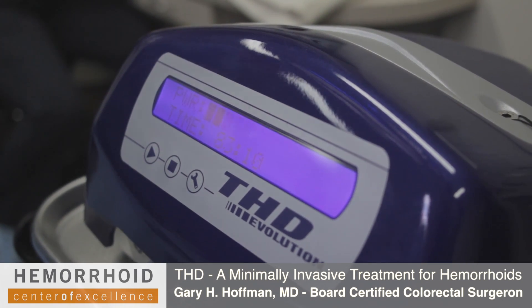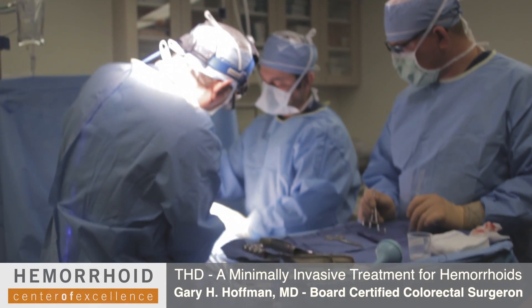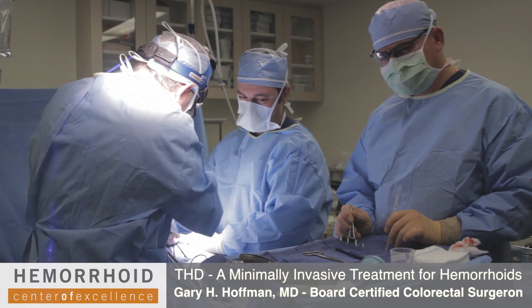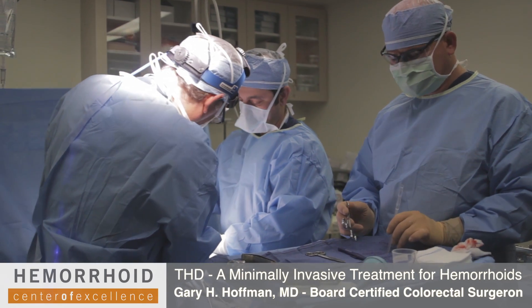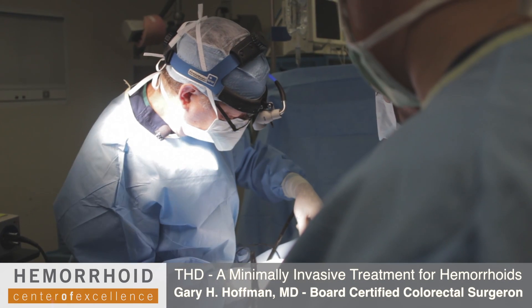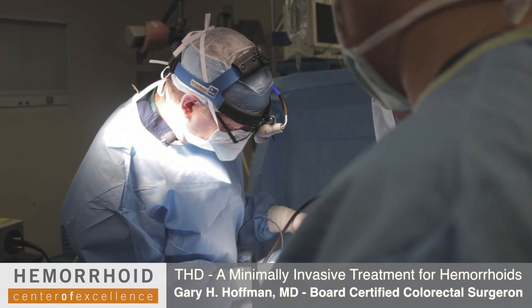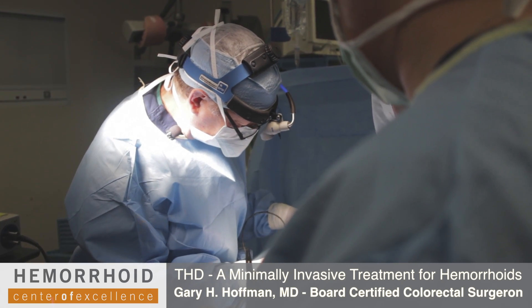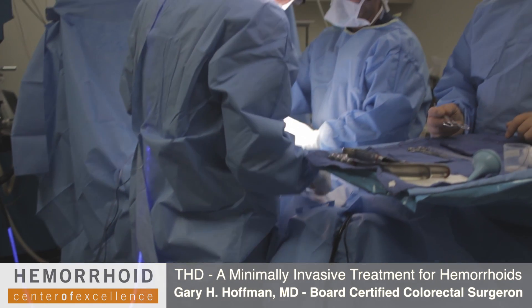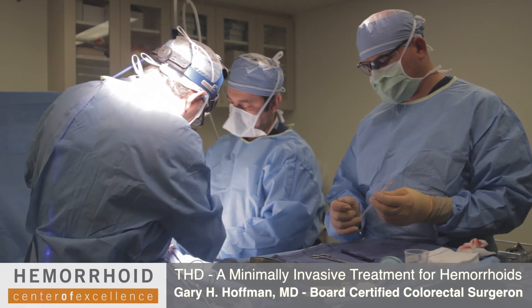The second group is actually larger than the first. Again, there's a cessation of blood flow when I tie the stitch, and the arterial blood flow into the hemorrhoid, which is an artery and a vein, has now stopped. It's similar to the first hemorrhoid. We will simply replace this hemorrhoid back to where it originated. Let's go ahead and remove the roof.